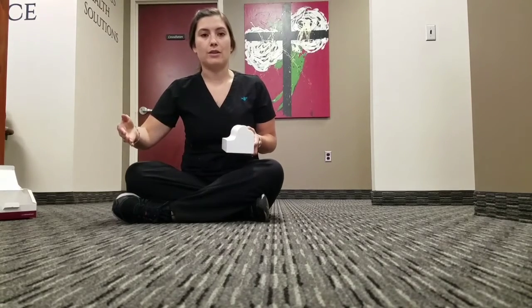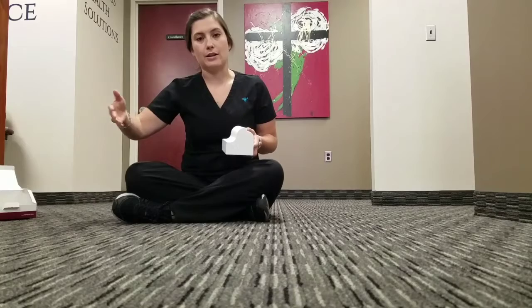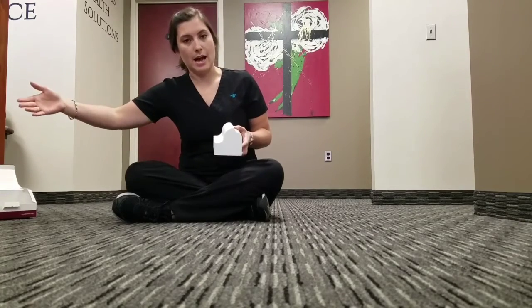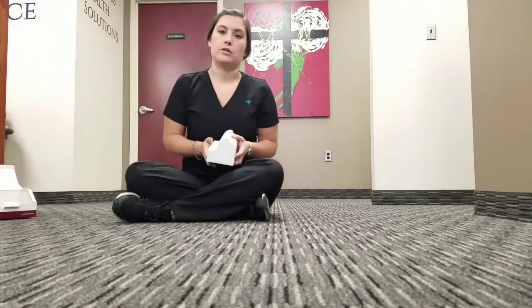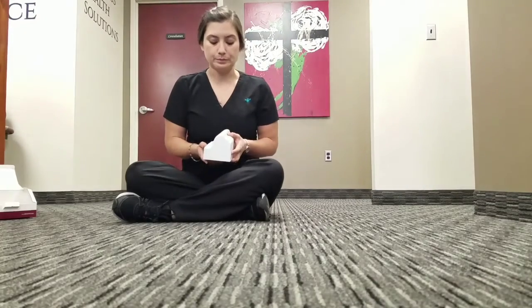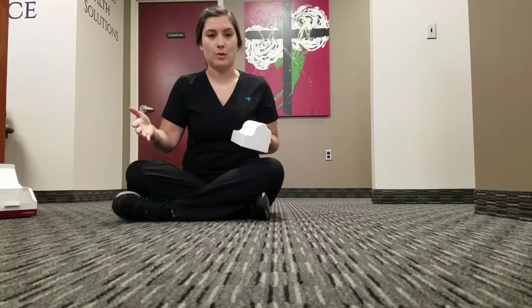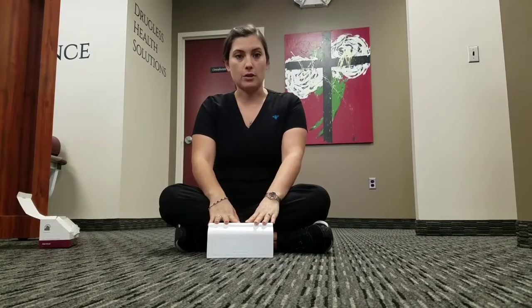You'll remain at 30 seconds, or 30 seconds higher than that at 1 minute. You'll remain there until you're not sore again, and then you'll move up to 1.5 minutes, and so on and so forth until you're doing 7 minutes total on this. So if you don't have any soreness after your first day, you just move right up to 1 minute for the next day. A couple things to note about using this Denneroll pillow.